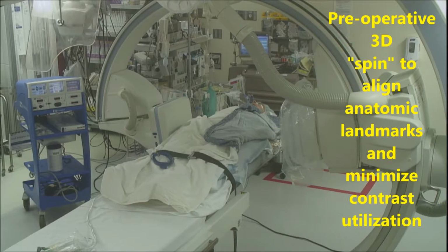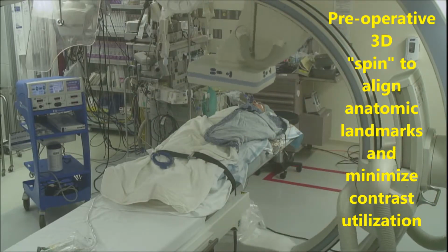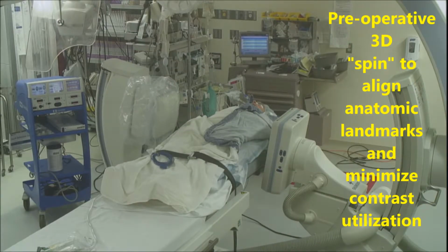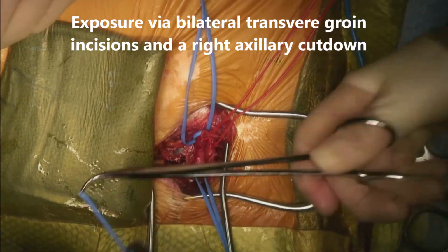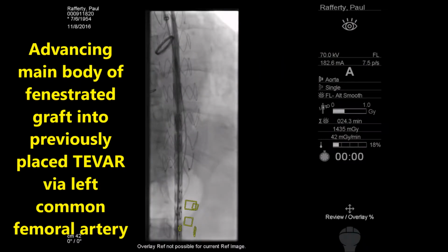A preoperative 3D spin is done. This allows us to align anatomic landmarks and minimize contrast utilization throughout the case. We start the case with bilateral groin exposures and a right axillary artery exposure. After the TEVAR is deployed, the main body of the fenestrated graft is advanced via the left common femoral artery.